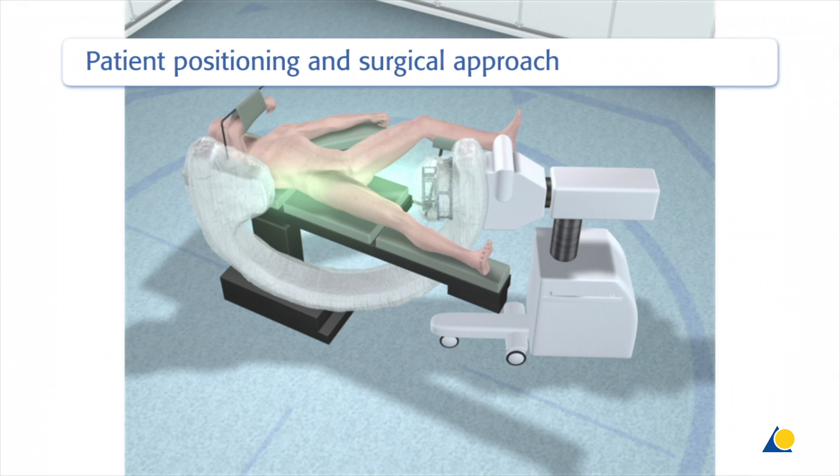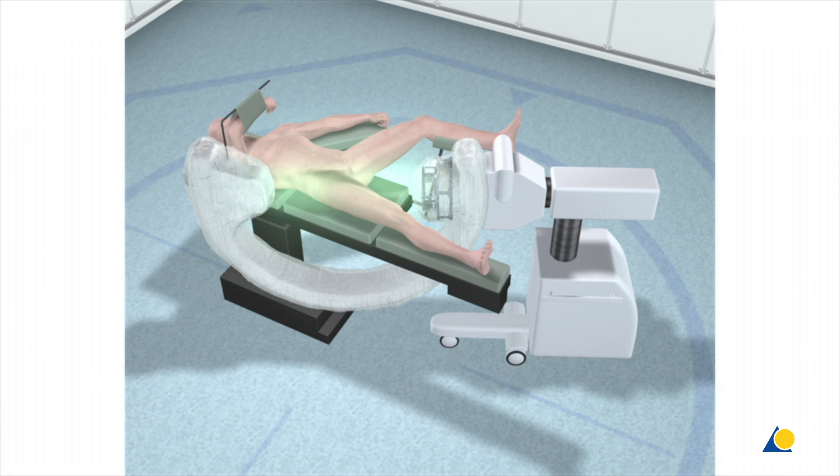The patient is positioned supine on a radiolucent OR table with the uninjured leg placed in a leg rest in flexion and abduction to allow for an image intensifier to be placed between the legs.